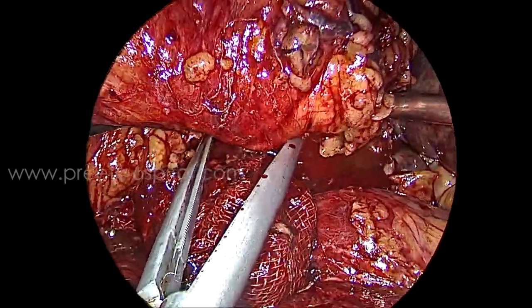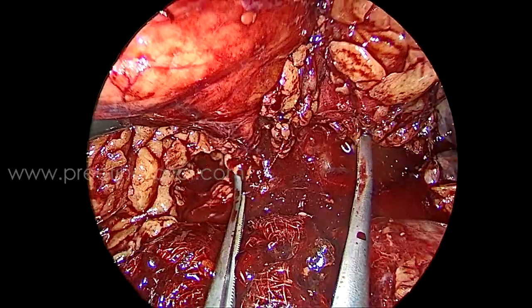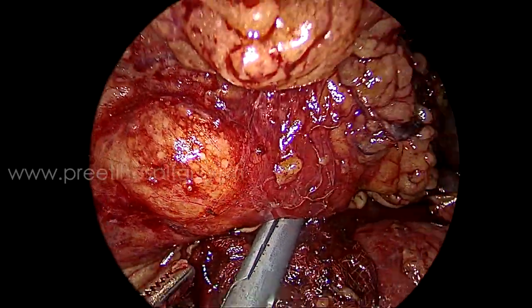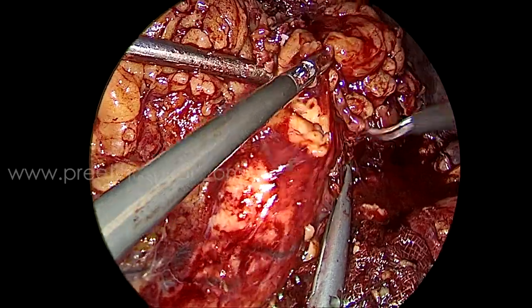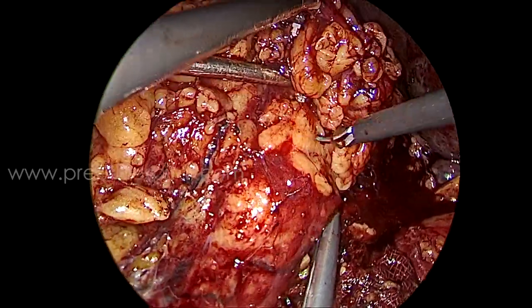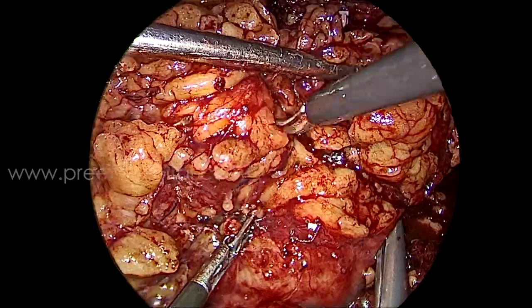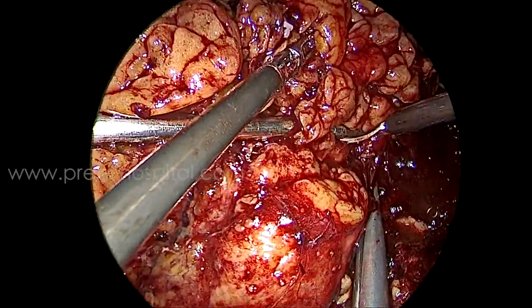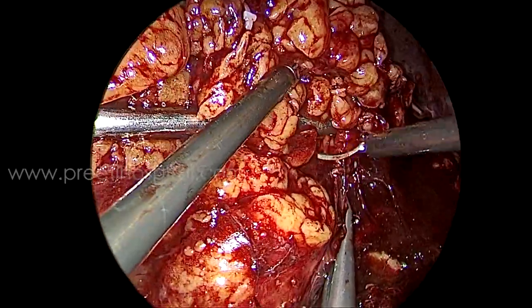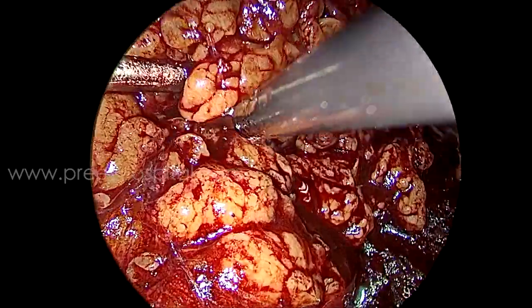Here we are doing mass clamping. After applying the clamp and removing the gauze piece, we cut — see how much fat was coming. One person is retracting, still fat is coming, and it is bleeding. The fat was not separable.